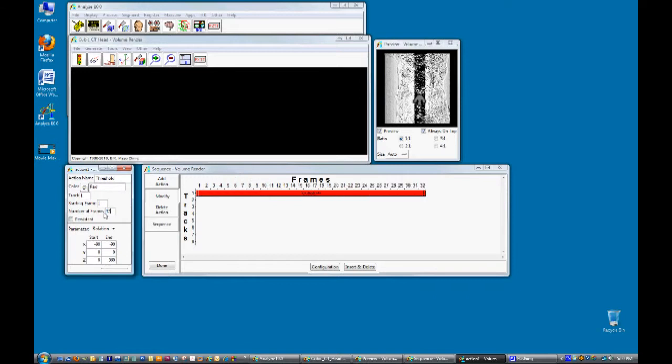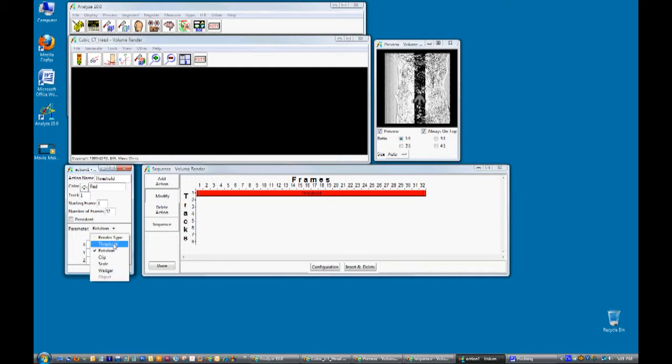16 frames are needed to generate 1 second of movie. Let's update this movie from a rotation to a threshold. Select the threshold parameter from the drop down menu. Set the end minimum threshold to 145. This provides a threshold level that will show us the bone.